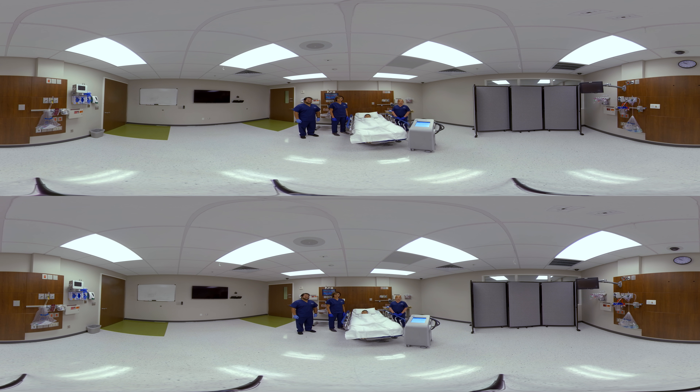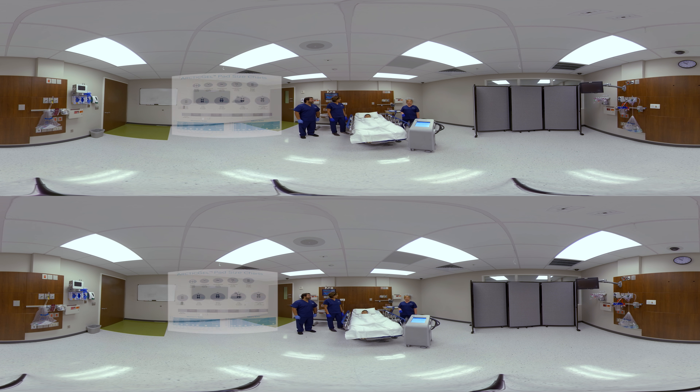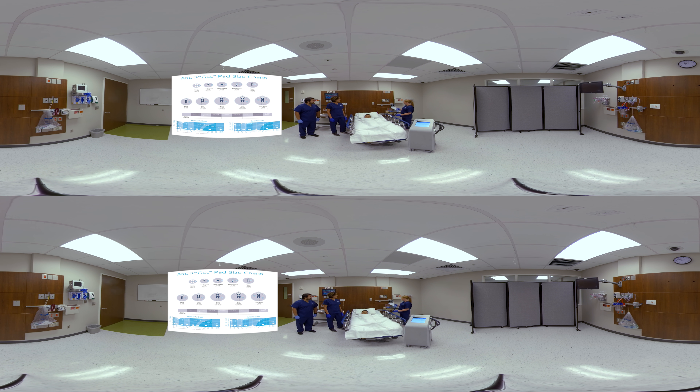When treating a pediatric patient on the Arctic Sun STAT temperature management system, pad sizing is very important. You can use the pad size guide hanging from your device. For our patient Cruz, we can use two different types of pads: either the small universal pad or a set of extra extra small. First, let's demonstrate the small universal pad.